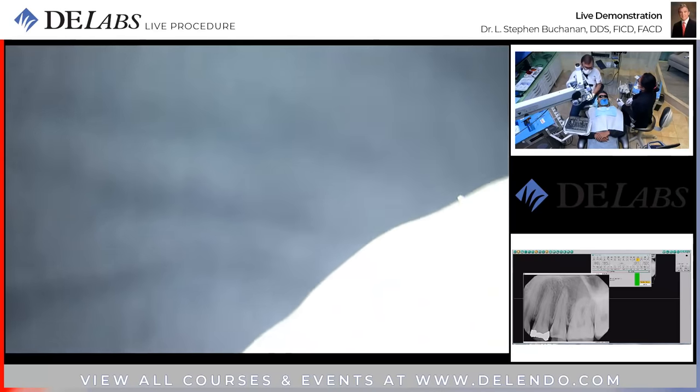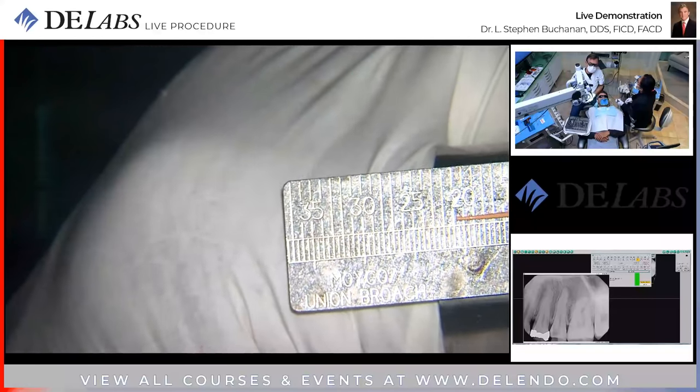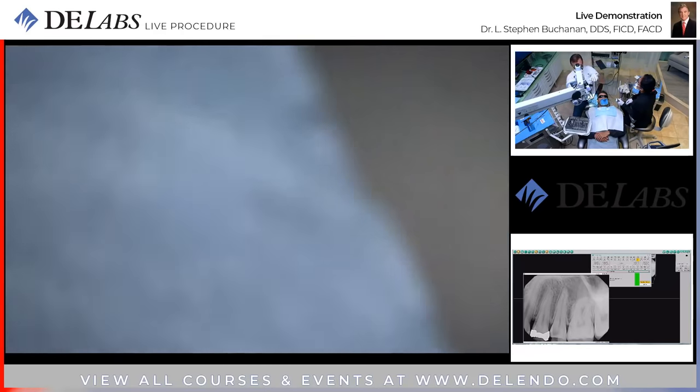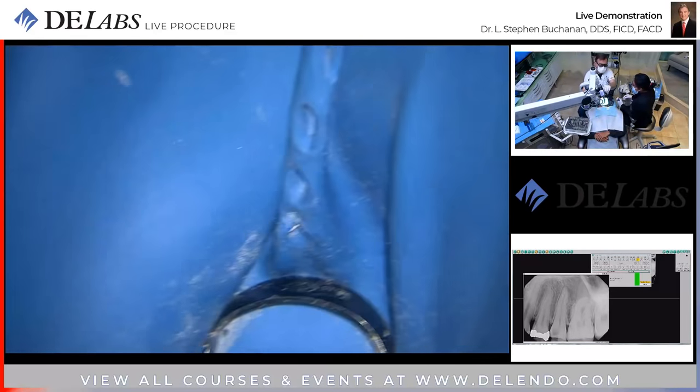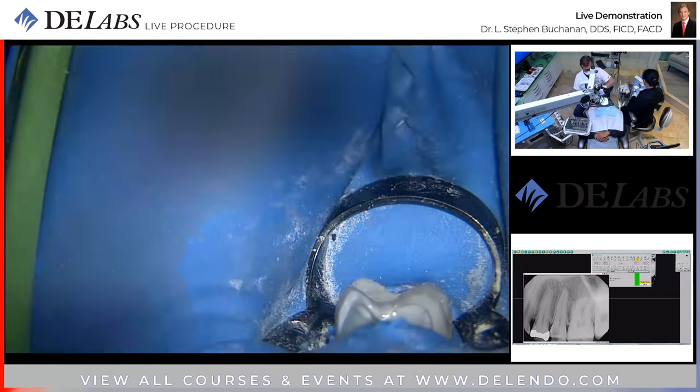Length of the canal, we want this to fit at least to 21, and it does. It's actually perfect. It's 20 3/4. I think we've lost a little bit of length in this case. Let's go ahead and take a radiograph, and we'll find out shortly.